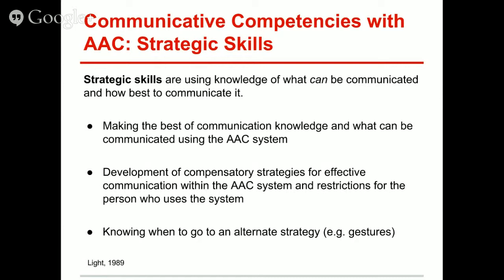In some circumstances, like noisy places such as the cafeteria or in the community at a sporting event, the use of a gesture, for example, pointing or motioning, may be a better strategic communication strategy than using the speech output feature on their device.